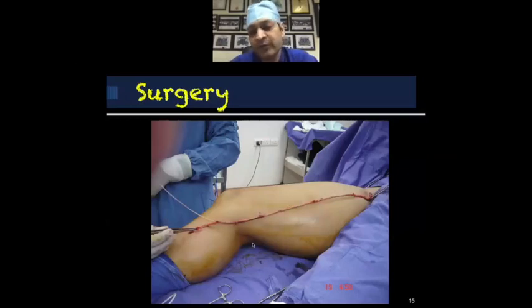Now, surgery. This is one of the earliest patients, around 10 years back, and I think this is one of the last patients. We have stripped the long saphenous vein, and this is also under local anesthesia with Tumescent. It is not under spinal or GA. You puncture and take the long saphenous vein at the knee level, then pass a stripper, then under ultrasound, see the stripper down there, make a small cut, and take the vein out, ligate the long saphenous, and strip the whole long saphenous vein after Tumescent.